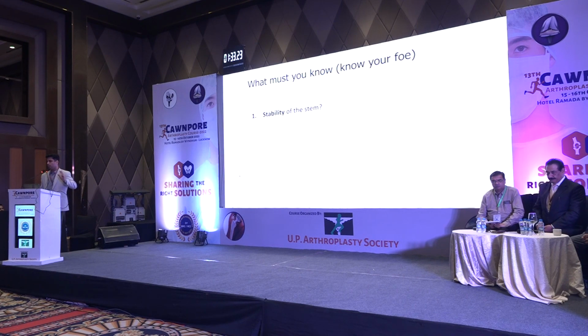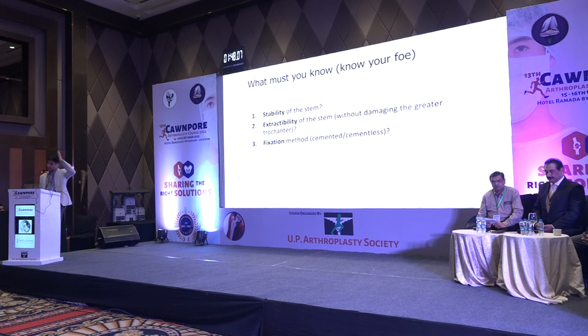So what must you know? You must know whether the stem itself is stable, just like you would in a revision. You must know whether the stem is easily extractable or not. And trust me, cementless stems are not easy to extract, so be prepared for that. Try not to damage the greater trochanter because that's your lifesaver. Otherwise, you'll end up with dislocation whatever you do. So the greater trochanter and the abductor mechanism are your life-saving guide.